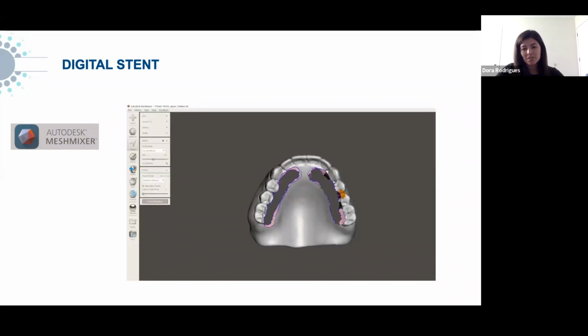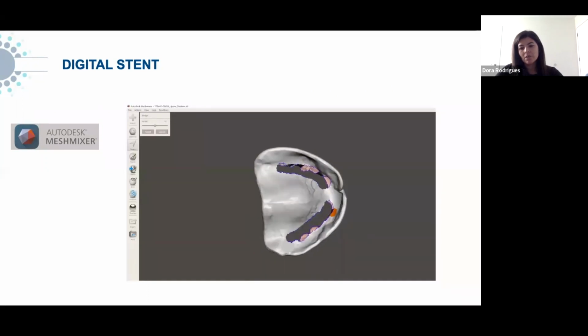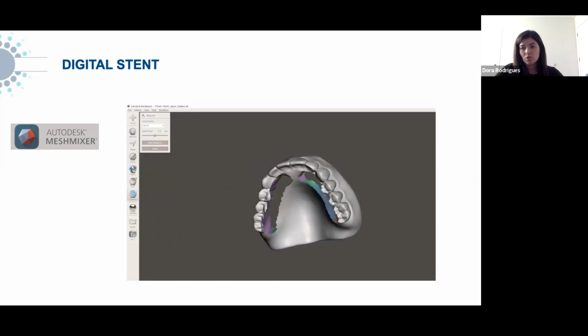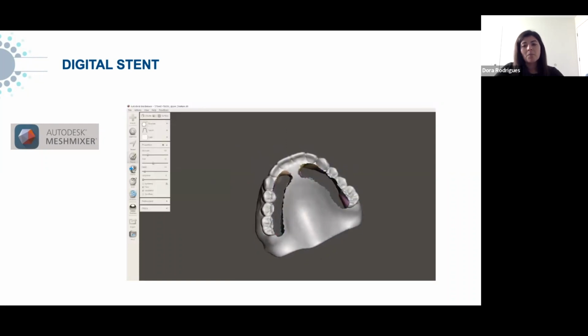So Mesh Mixer has a feature that if there are small holes in your scan data, it just removes them. And that's what we're trying to do here. We're bridging these different parts of the denture, making small holes. So when we go to analysis, the software itself right here closes all the holes. This video is sped up a little bit, but in less than 5 minutes, you can create your stent. Very easy to do.